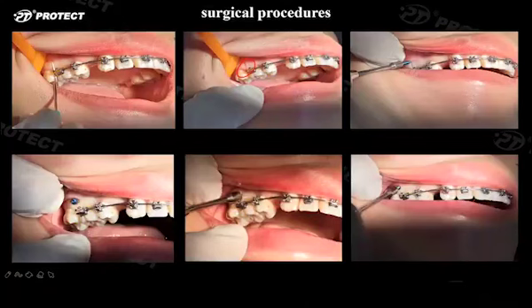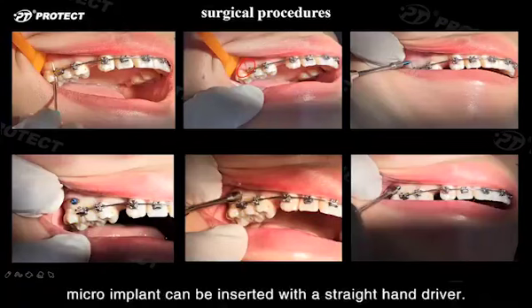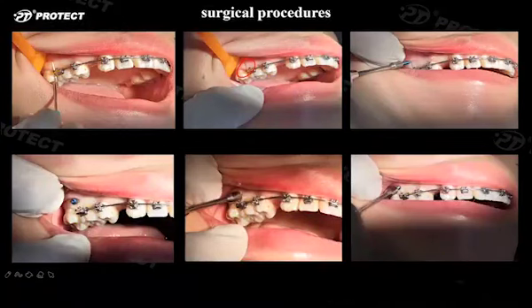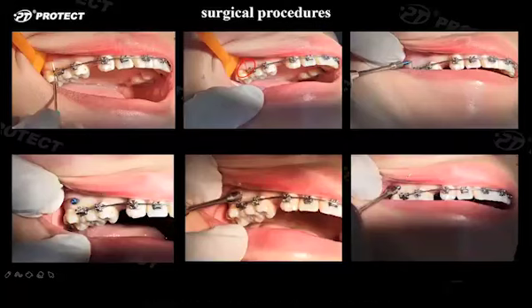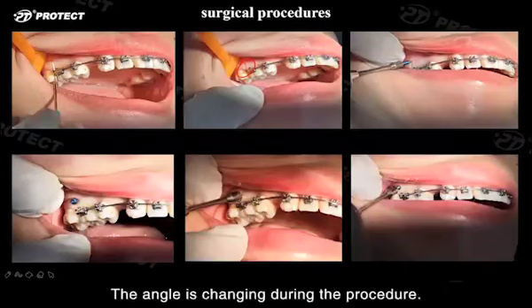After that, the micro-implant can be inserted with a straight hand driver. Vertical to the bone surface at first. When the cortical bone is penetrated, the angle can be changed. The angle is changing during the procedure.